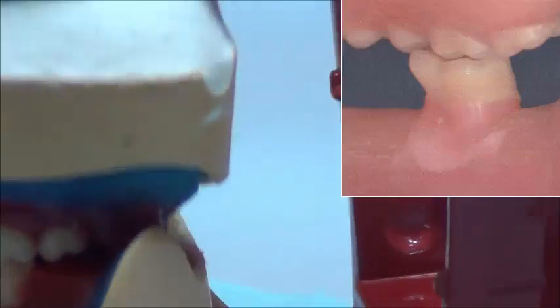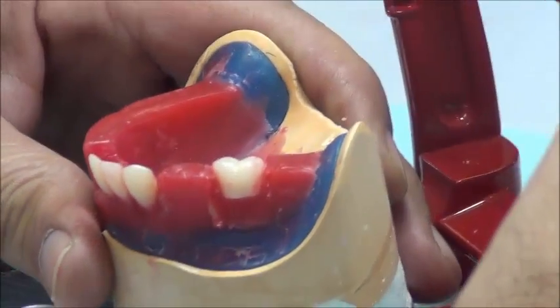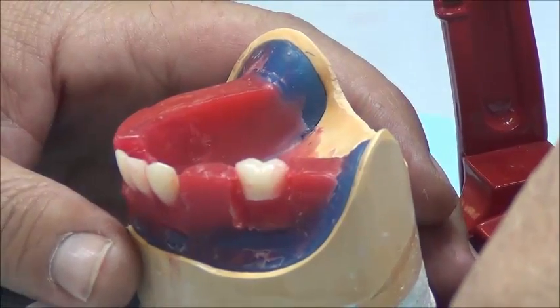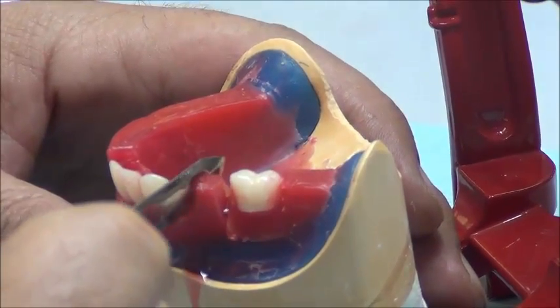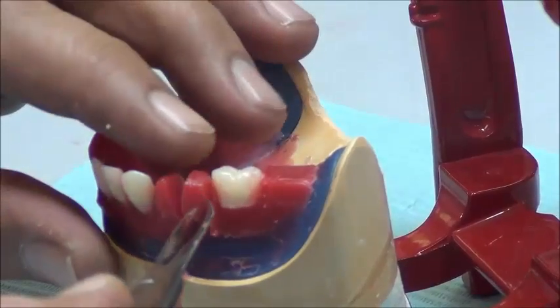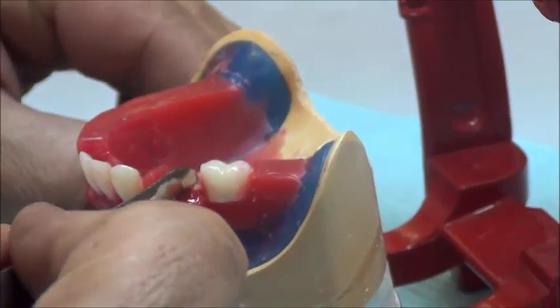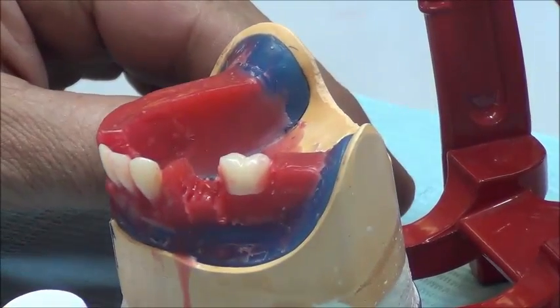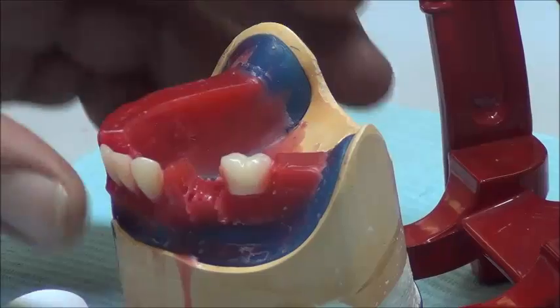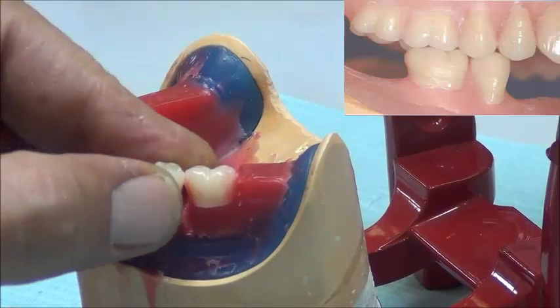So now that tooth number 6 is finished, we could go either to the back or to the front. Meaning that we can set tooth number 4 and 5, or we could set tooth number 7. They're equally the same. And notice that after we have set tooth number 6, the wax that we are removing now is some space for tooth number 5. But before we remove it, the upper premolar was touching on this wax. So each time before I remove any wax, make sure it's still touching.